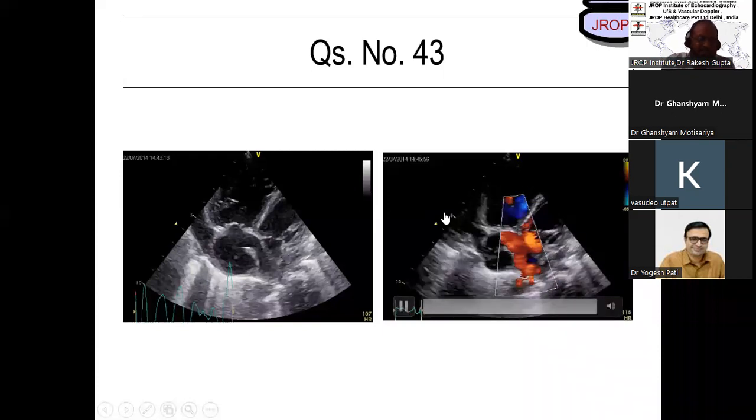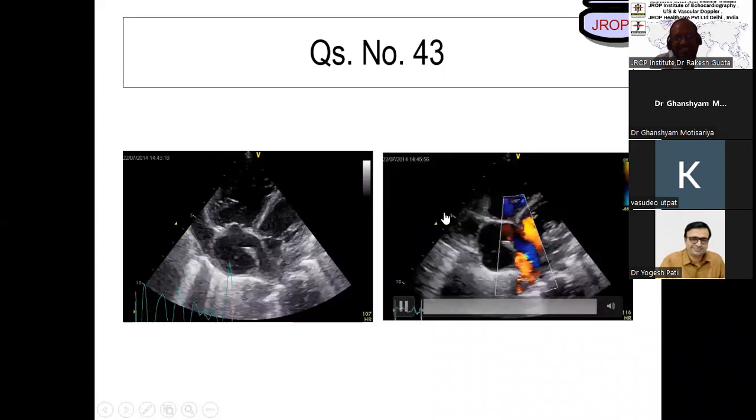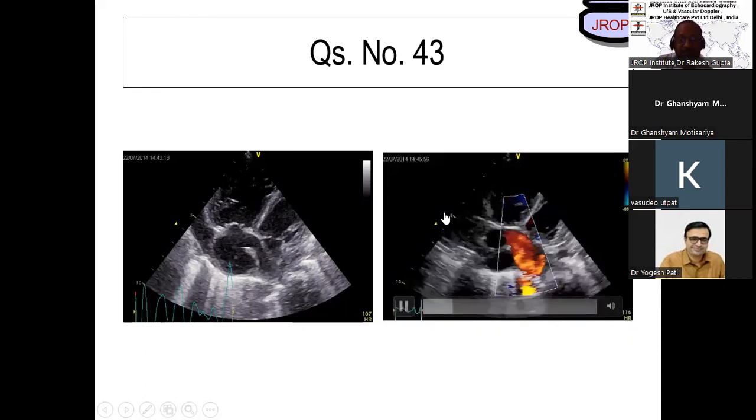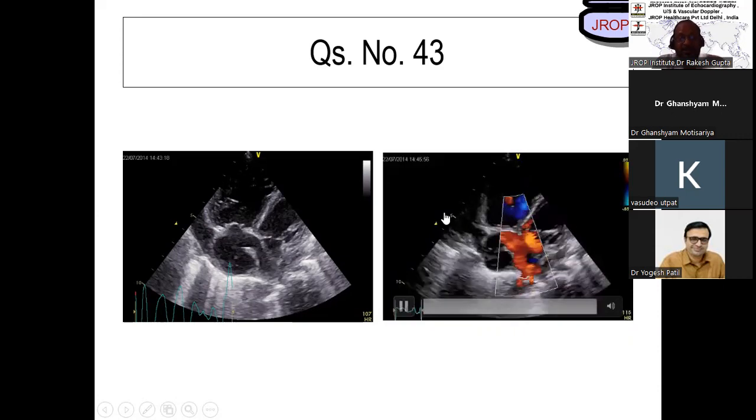You always compensated with others' number, you know, Yogesh. Yes, sir. And both the times you got a difficult question. Yes, sir. So it appears some membrane in the left atrium where the flow is getting less. I don't know. Now attempt. You're coming closer, you know, attempt.